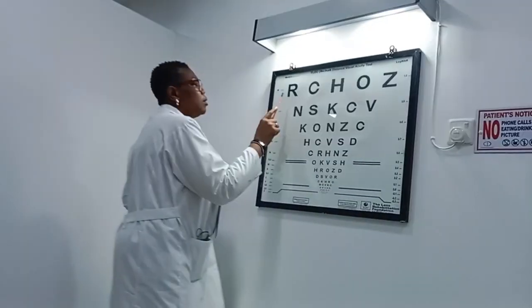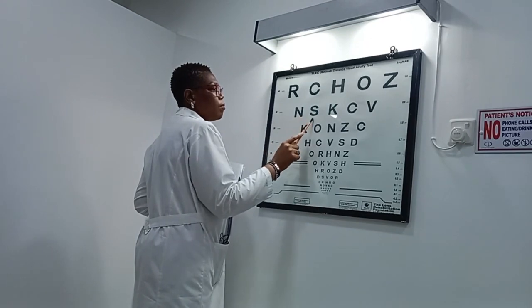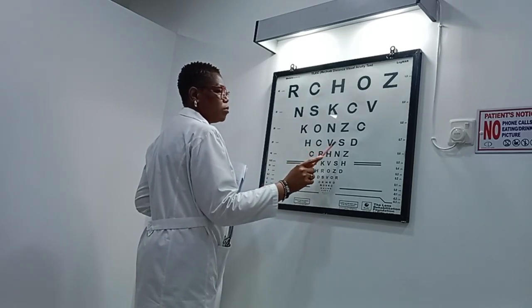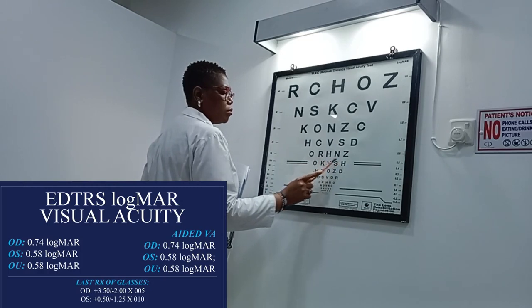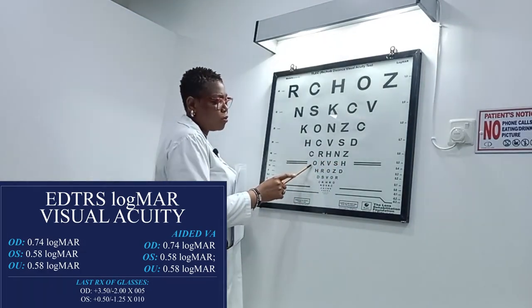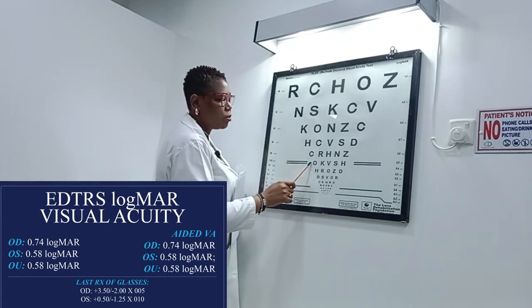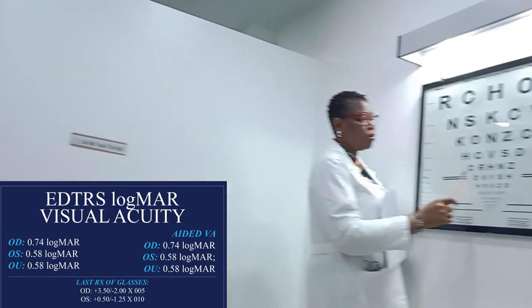So let's take it again. Which other one can you see? O S.